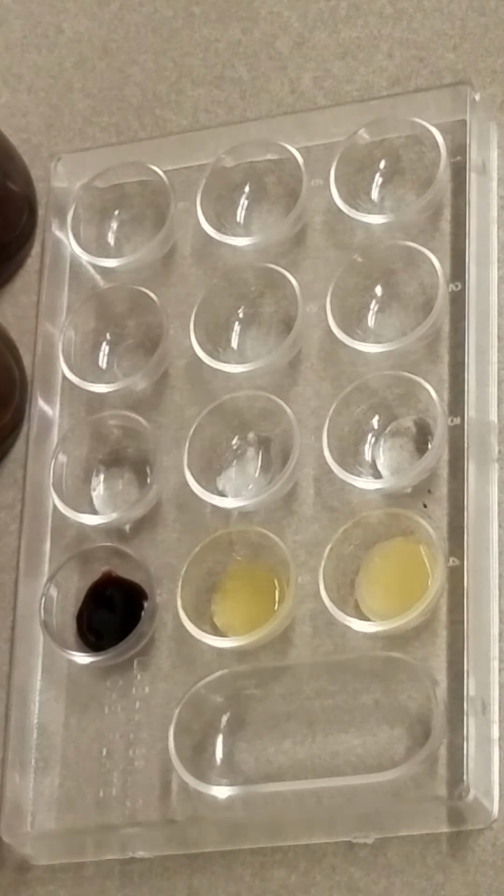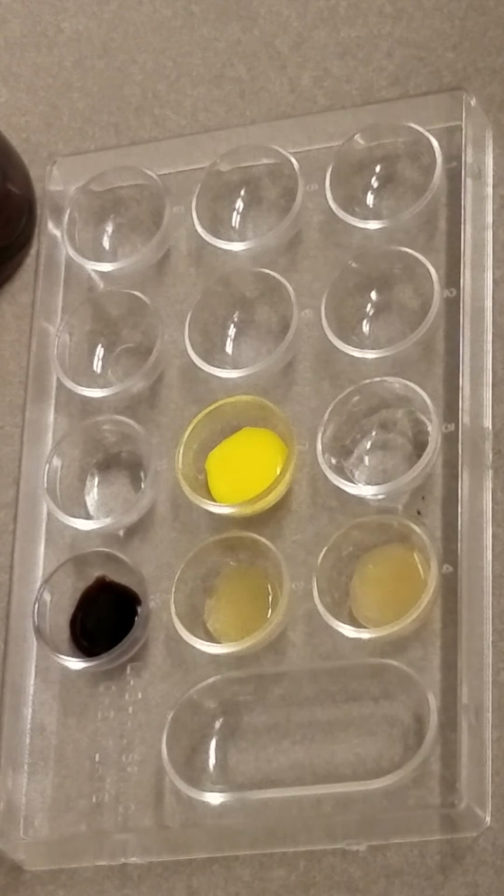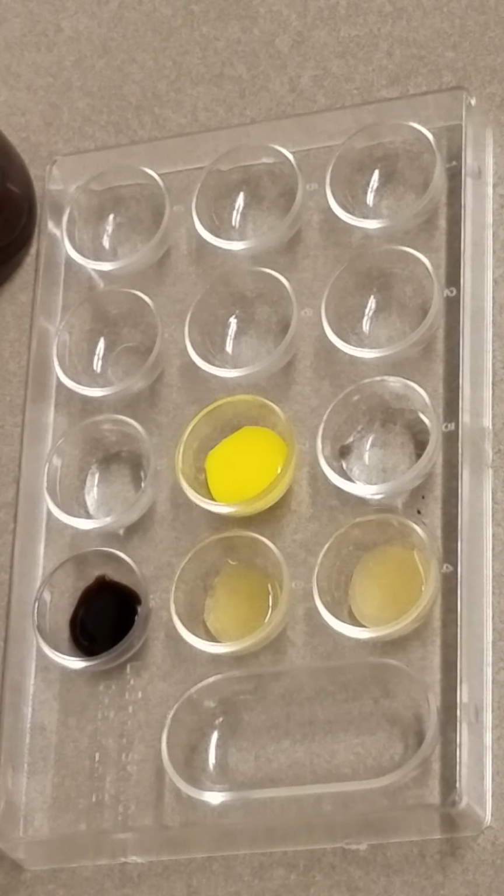So now I have AB positive, and I would expect that I would get a reaction with all 3 because it's going to have all 3 antigens. Sorry, I misspoke. I said antibodies, but it has all 3 antigens. So I'll add a few drops of my AB positive blood.